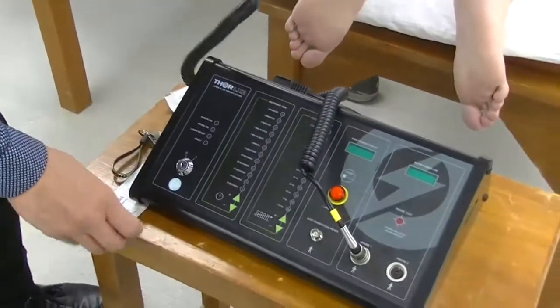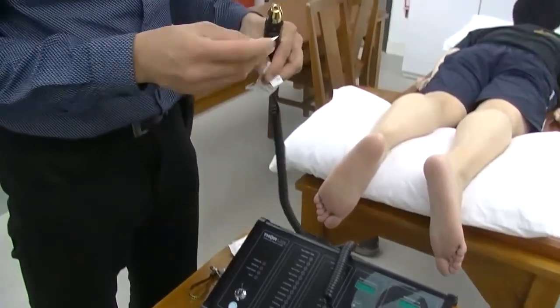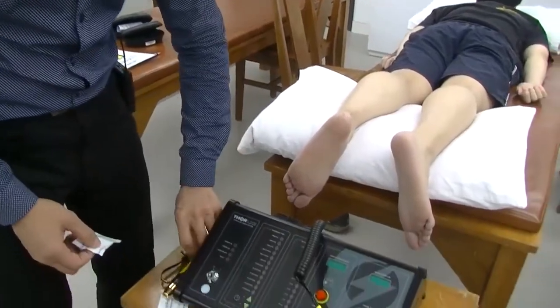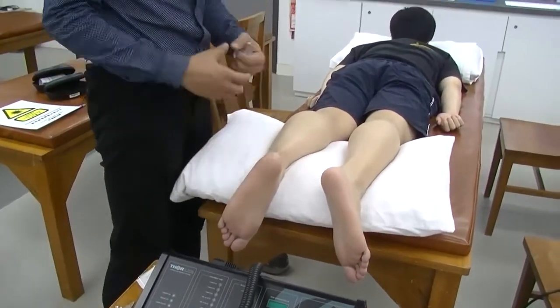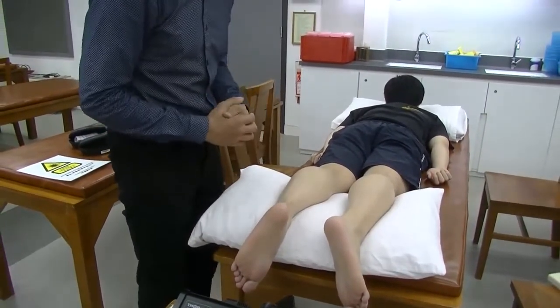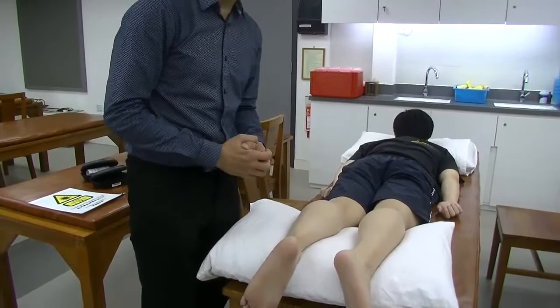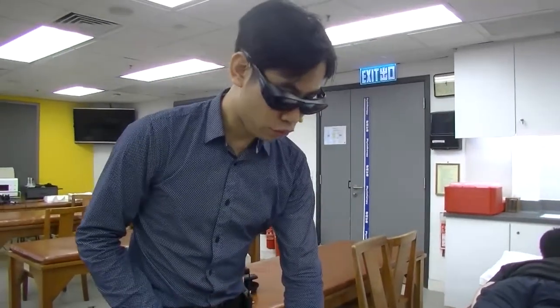After the 30 seconds are done, turn off the machine. Remember to clean the probe, as it may have been contaminated from contact near the wound. Then proceed with the remainder of the wound dressing and examine the wound. No immediate visible changes are expected at this stage, but a photograph should be taken for documentation and reassessment at the next session. This concludes how to operate this laser machine.